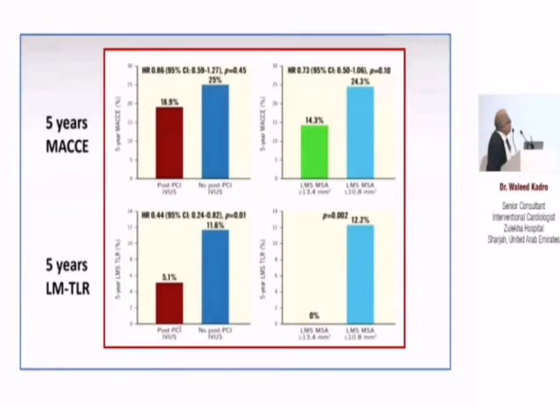Look at this improvement in target lesion revascularization if you use IVUS, 5.1 compared to 11.6, and the p-value is significant. Again, if we get better result by getting much larger minimum lumen area, the trend to improve mortality is much more prominent. And look at our target lesion revascularization. 0 is 0 if you get the left main stem area or the minimum lumen area more than 13.